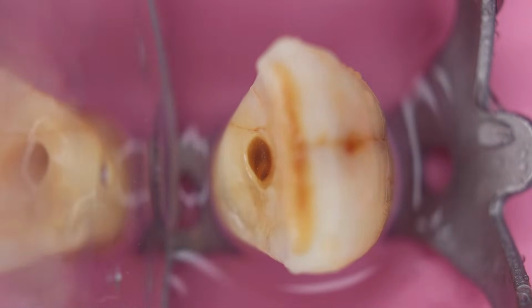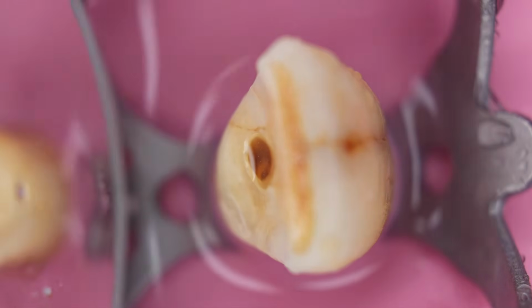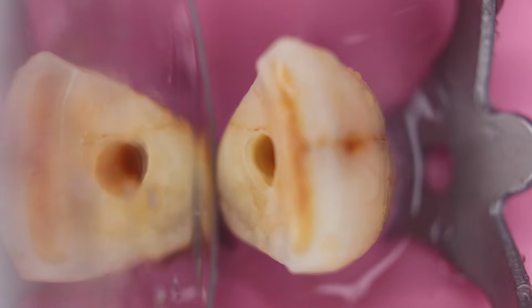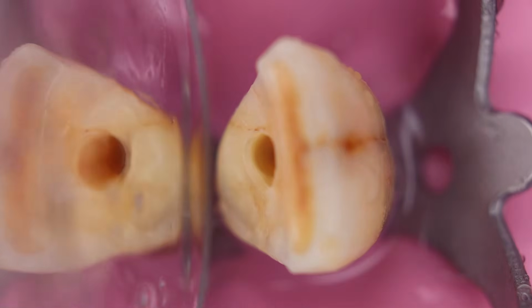So now you can see the darker area that we are able to visualize. So use your DG16 probe.